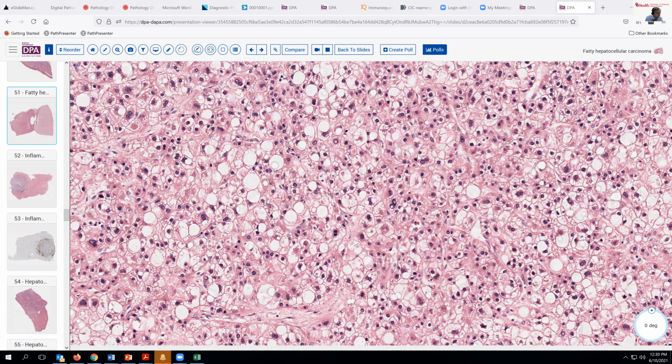In terms of evaluating the tumor, reticulin is probably the most useful of those histochemical stains because it can help you to identify that your architecture is not that of a cirrhotic liver, but of a lesion without typical sinusoids or liver cell plates. And so this isn't just fatty tissue or a dysplastic nodule. This has actually become neoplastic.